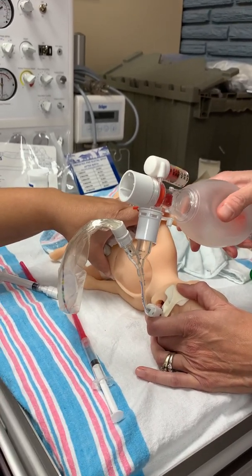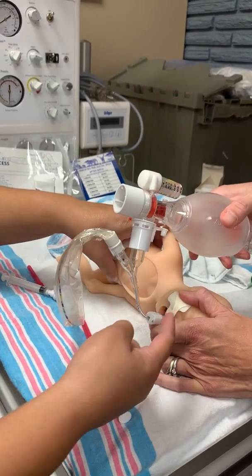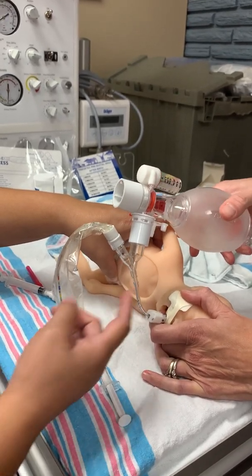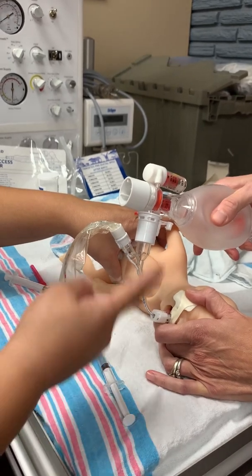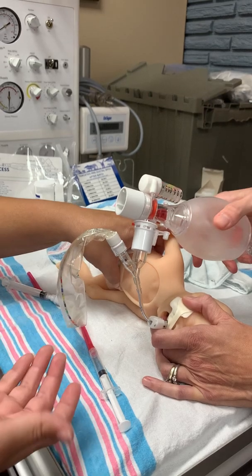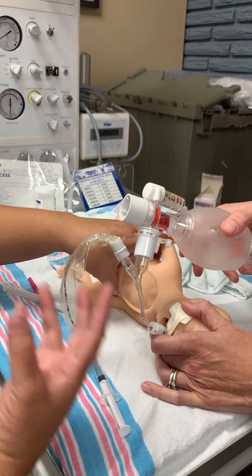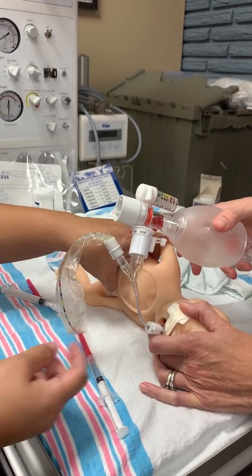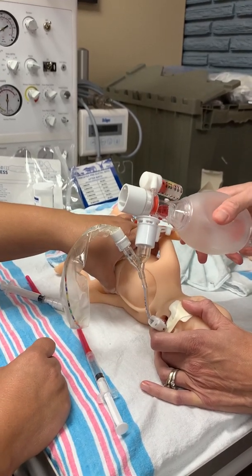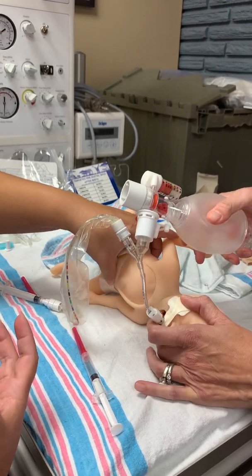So we're going to bag that first dose in until it's completely absorbed. If you see any kind of regurgitation of the surfactant, you may want to give a little bit of a longer inspiratory time to help distribute that into, in theory, that left lung first. So we're gonna wait until you no longer either hear the rhonchi with your stethoscope, or until you no longer see any of the surfactant coming up and out of the tube. So after a couple of minutes, we feel like it's been absorbed. We're going to move them back supine.